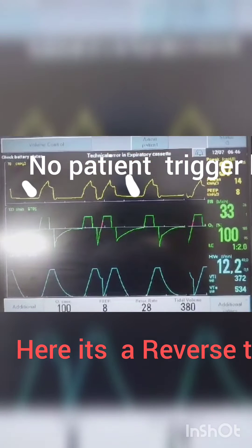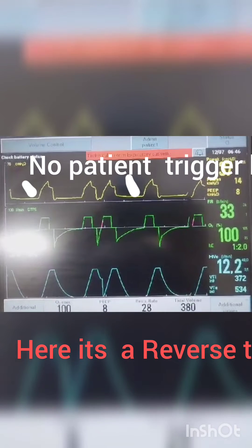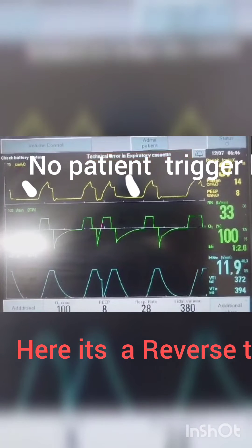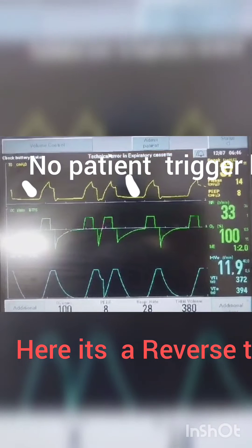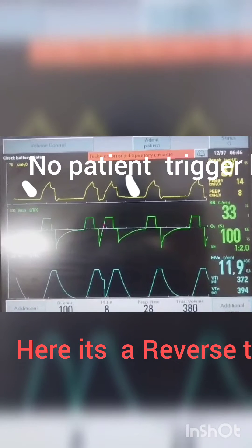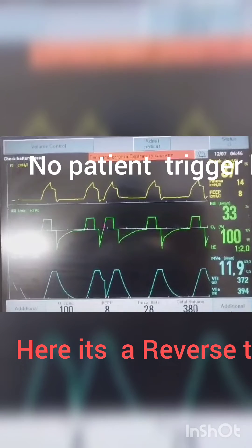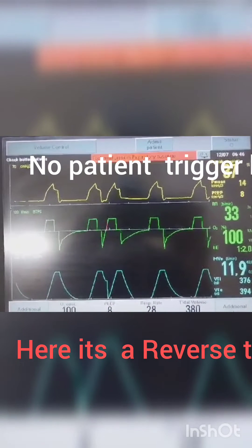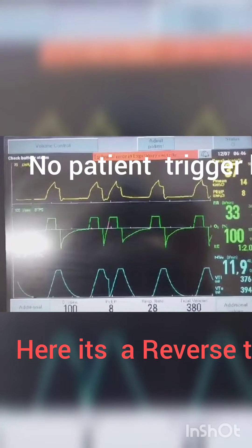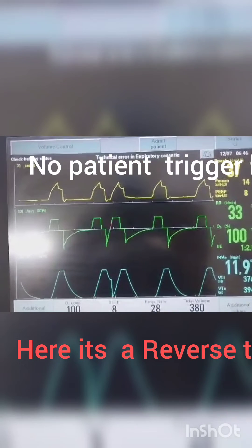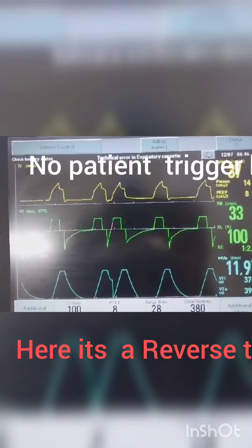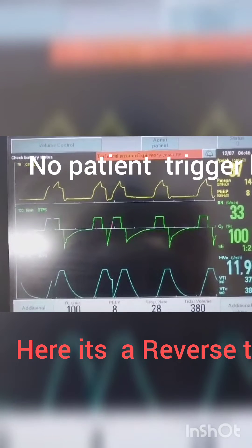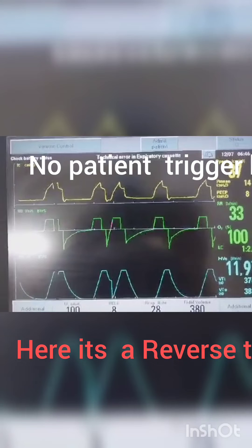What's going on here? You can see there is one after another two tidal volume generation going on — one tidal volume followed by another tidal volume. So, it is either reverse trigger or double trigger.